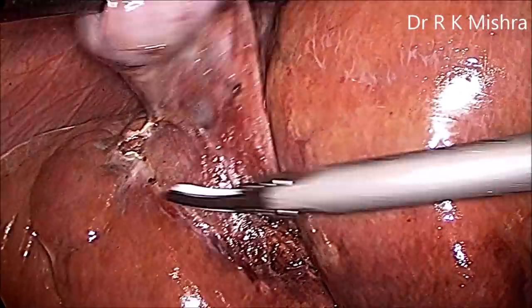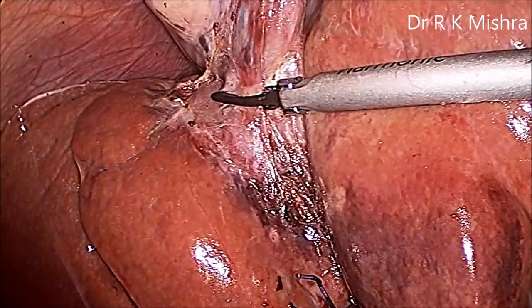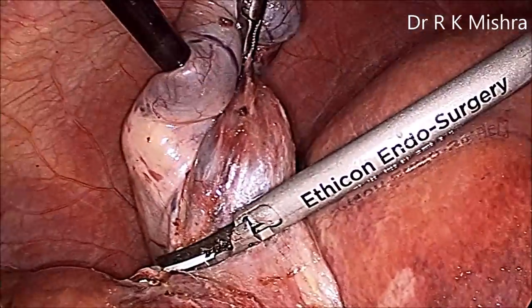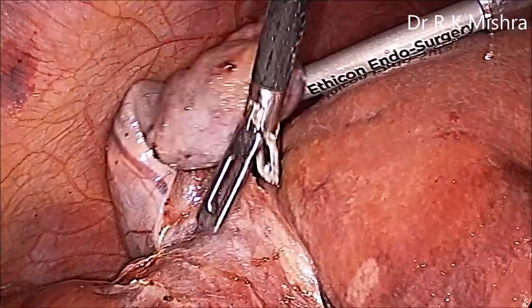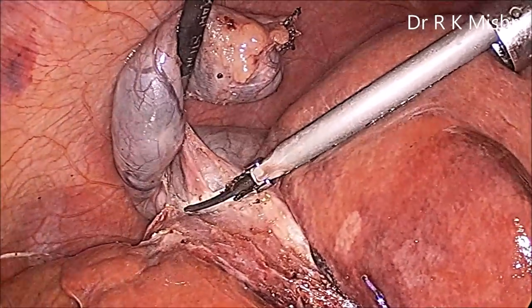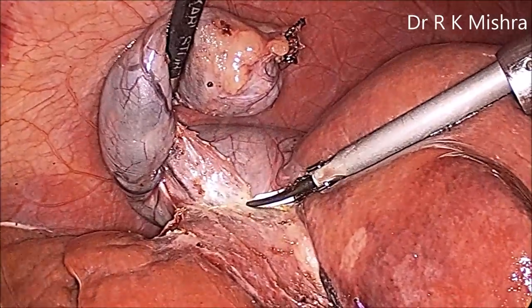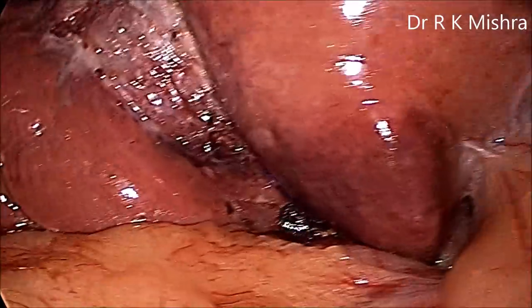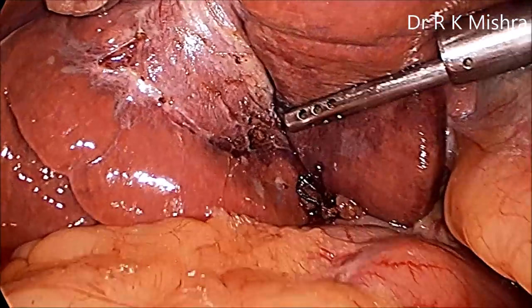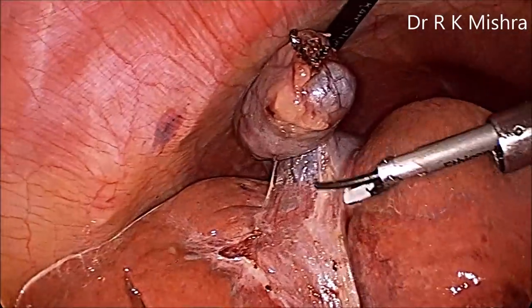If you have a 30-degree telescope, keep the light cable down while separating the gallbladder from the liver. The Teflon jaw of the harmonic scalpel should be kept towards the gallbladder so the active jaw does not puncture it. Slowly separate it — it is almost done. Once you reach the last part of the fundus, inspect below to check for any cystohepatic duct of Luschka or any other abnormality or bleeding. Confirm there is no bile leak, the knot is fine, the clip is fine, and everything is clean.